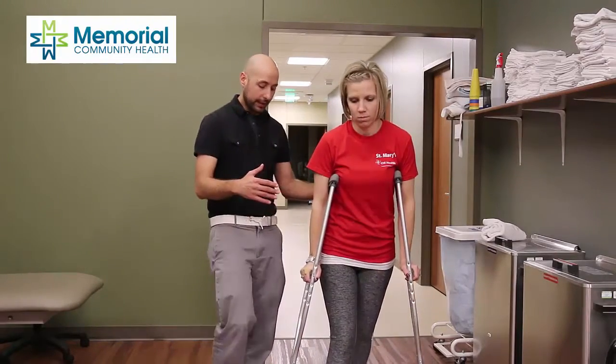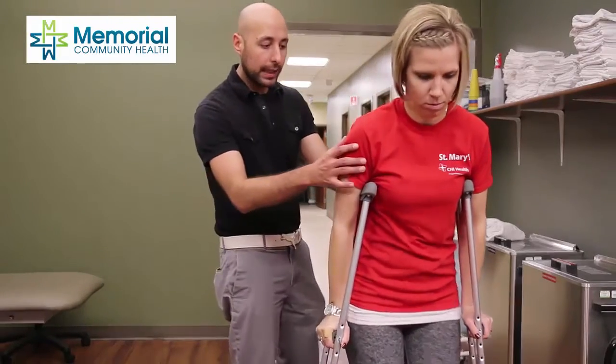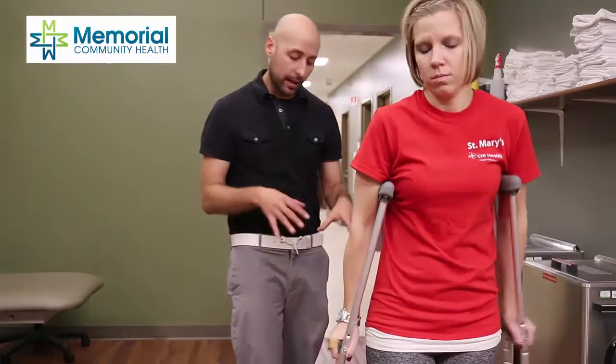If that feels easy, we can step through with our leg, but once again, only keeping about 20% of our weight on that affected leg, just enough to help us balance, but no true weight-bearing through that leg.